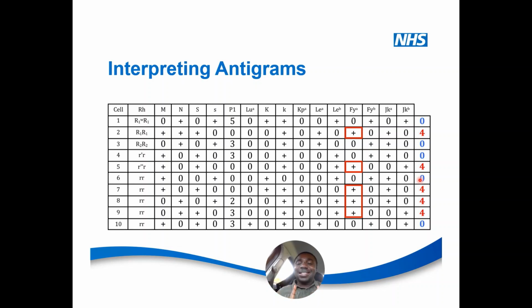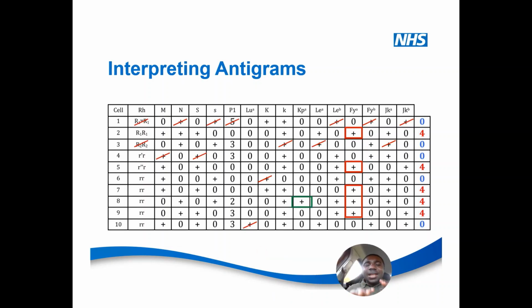Now let's look at another rule. So anyway, this is antibody Duffy A. From what I said in part 1, this is still simple to identify. But let me give you another secret. Before I explain this further, what I want you to understand is that there is a rule.